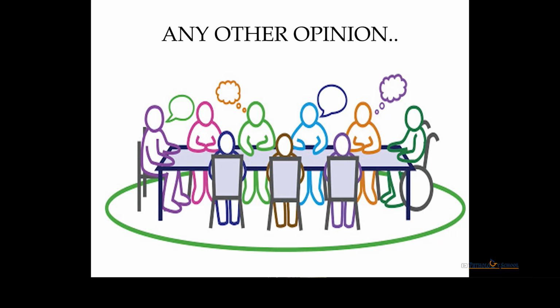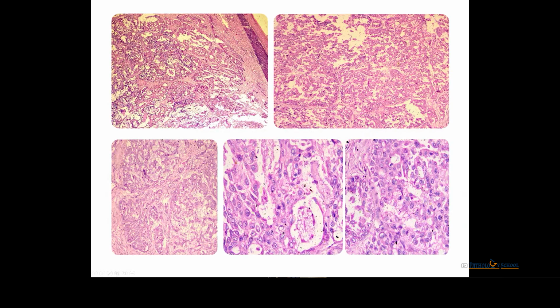I will be highlighting a few important features of the case. She was a 45-year-old female with a lower extremity mass, and the tumor was located in the subcutaneous plane and was infiltrating the margin. The tumor cells are arranged in a multinodular pattern and also in trabeculae as well as in cords against abundant myxostroma.